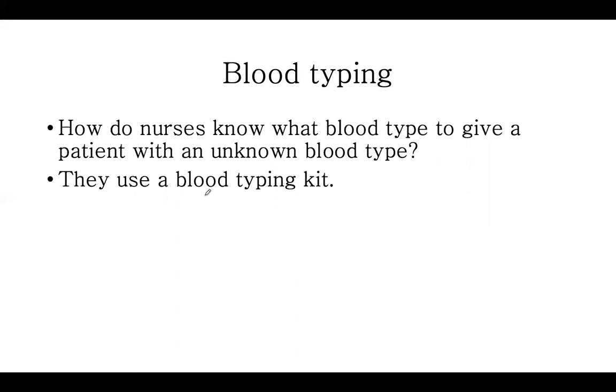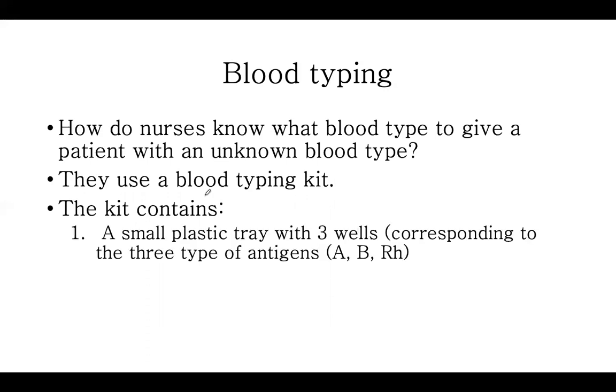Now, there are different versions. Of course, the hospital uses the, I guess, more hands-on, pretty fast techniques to figure out somebody's blood type. But regardless of what type of blood typing kit you use, the procedure would be very similar. The components would be very similar to what you would be carrying and observing in the experiment here. So what does your blood typing kit contain?